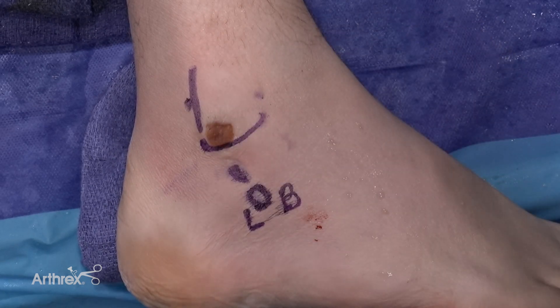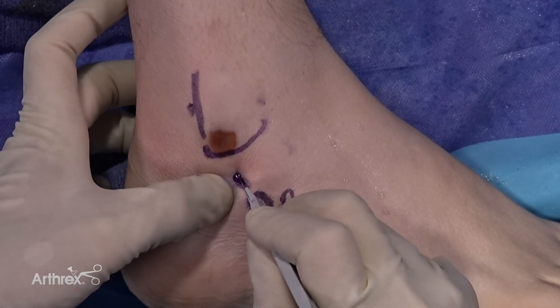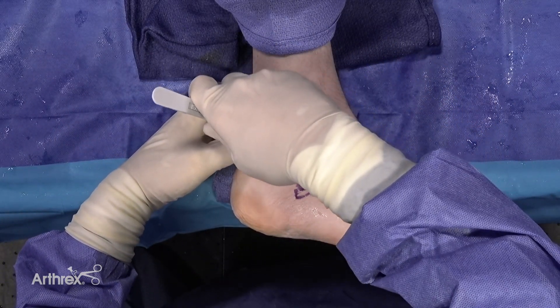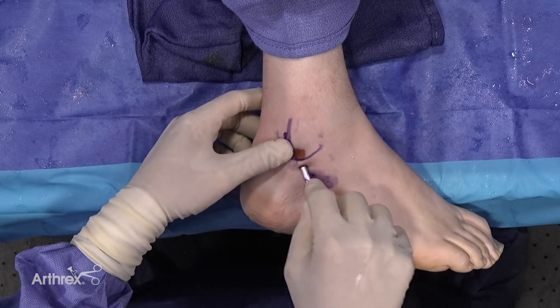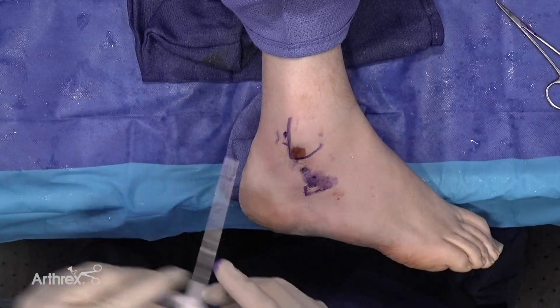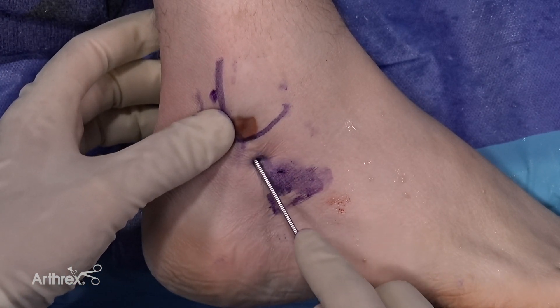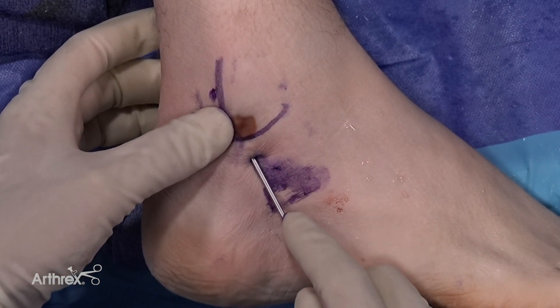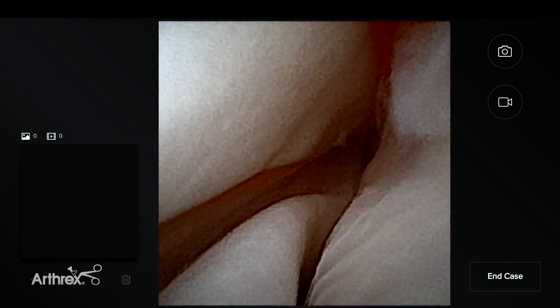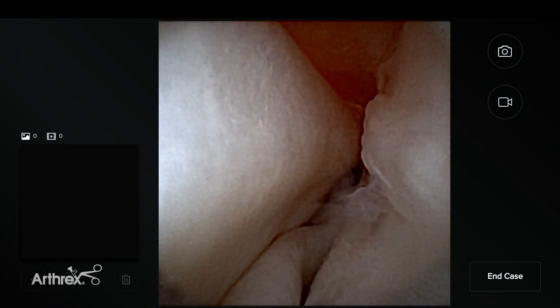I use 2 portals for this purpose. I mark also the proximal portal. Use a hemostat to allow the opening of the fascia, allowing us to put the camera in easier. Now use a blunt cannula for this purpose. When we insert, I palpate the cannula passing to the back of the lateral malleolus in case we have a bone spur at the tip of the fibula or deformity at the tip of the fibula.